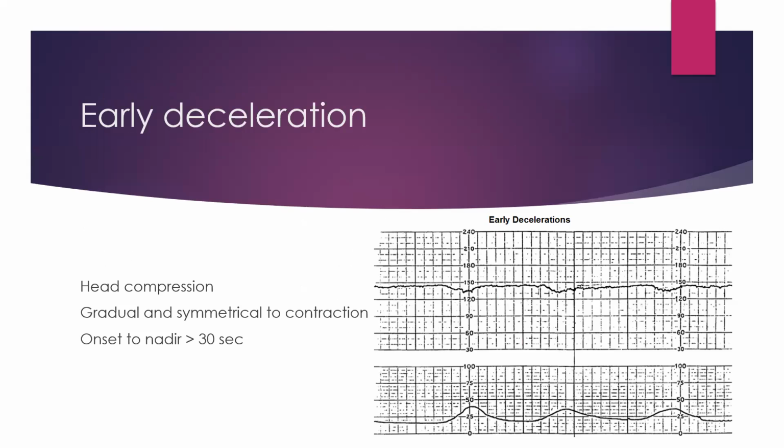So an early deceleration, like we said, is caused by head compression. So oftentimes we're going to see early decelerations when the baby is moving down the pelvis or the birth canal and the head is starting to get squeezed. We're going to see these subtle, gradual, symmetrical decelerations in the heart rate. These are relatively benign. They don't necessarily indicate intervention. It's just something to know and to give us a bit more information about what's going on with the fetus inside the uterus.